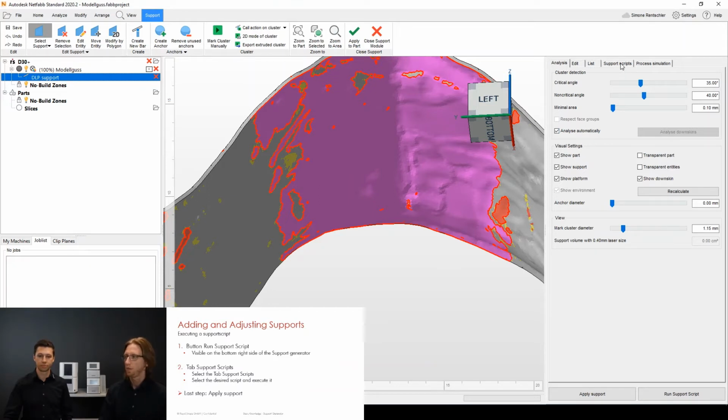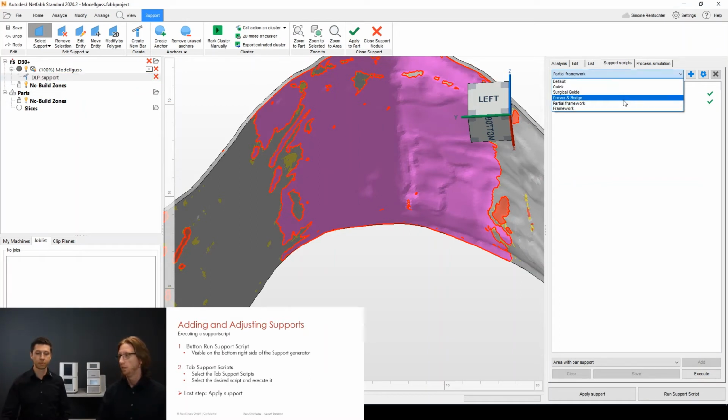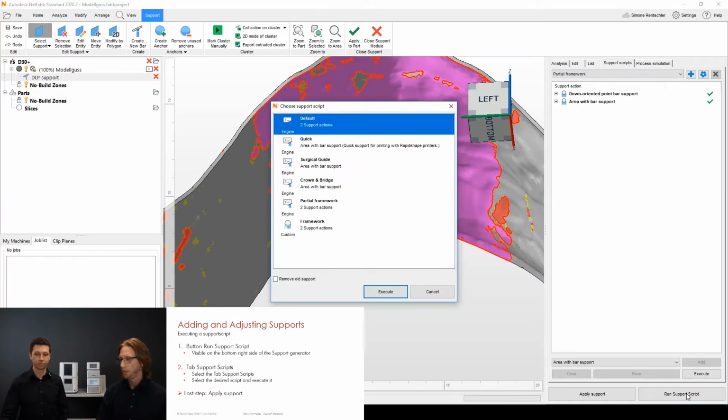The first option would be on the upper tab, which is called support script in the upper right corner. You can see there's a drop-down menu. In this drop-down menu you can just select the desired support script you want to have. For example, that would be partial framework, and then you just press the button execute in the lower right corner, and then it will perform the support script. The second option would be you just use the button run support script in the right bottom corner here, and by clicking that you are able to see all the available scripts in your NetFab version.